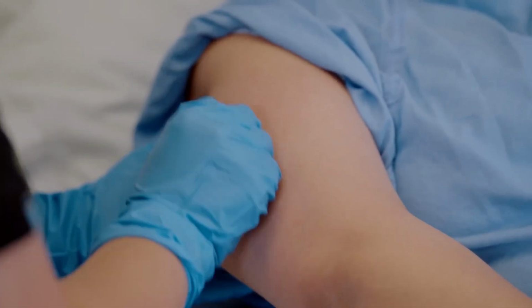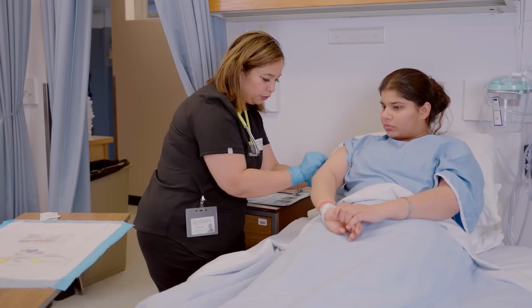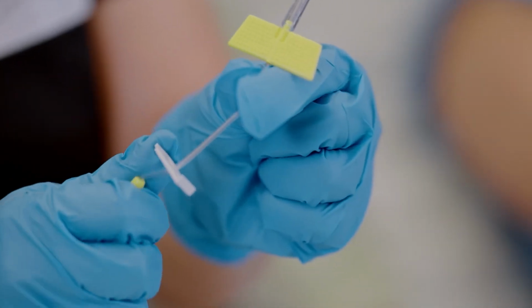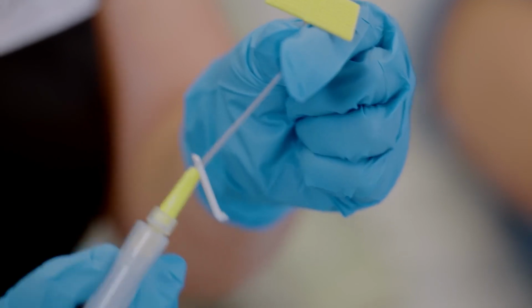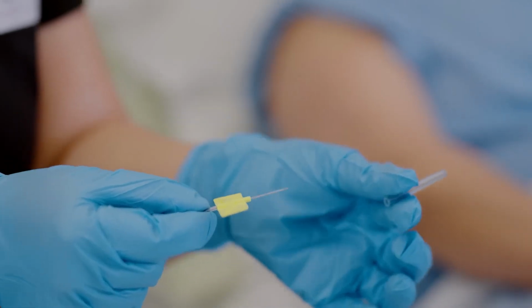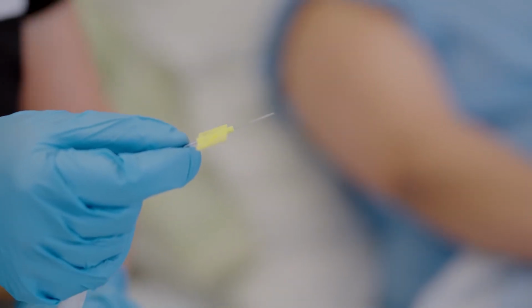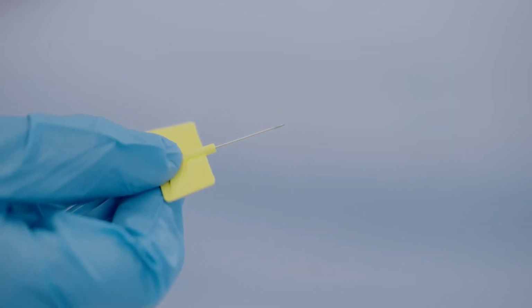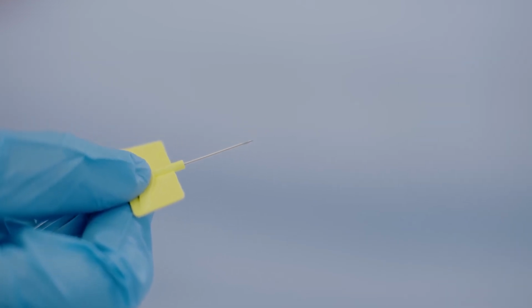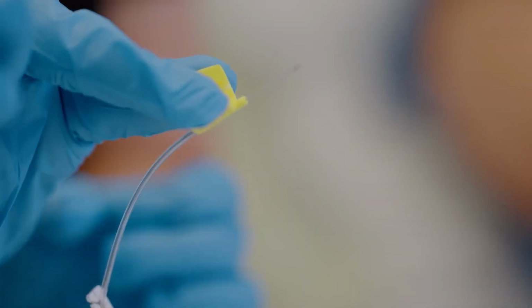Choose the site and cleanse with chlorhexidine or alcohol swab and allow it to dry. Remove site clamps from the subcutaneous butterfly if preferred, as a clamp is not required after insertion. Remove the vent plug and attach a needleless connector, luer lock to the side Y port. Now ensure the bevel is up and the catheter is not extended over the needle tip or bevel. Pinch the textured yellow wings together, textured side down.